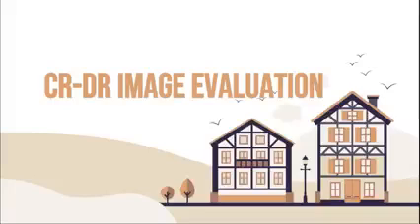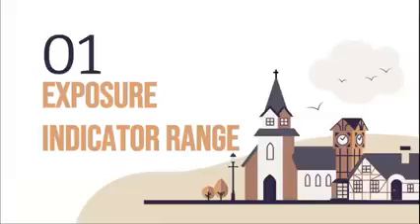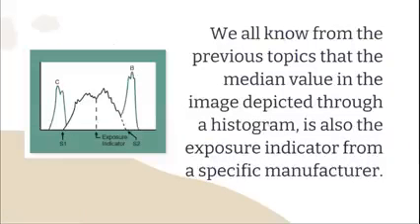Okay, so to start, let's go with exposure indicator range first. We all know from the previous topics that the median value in the image depicted through a histogram is also the exposure indicator from a specific manufacturer. So as you can see, pangitaon ninyo ang median value ang pinakatunga jud, this is kani. Okay, this is your exposure indicator.